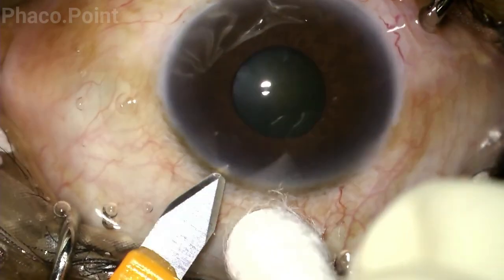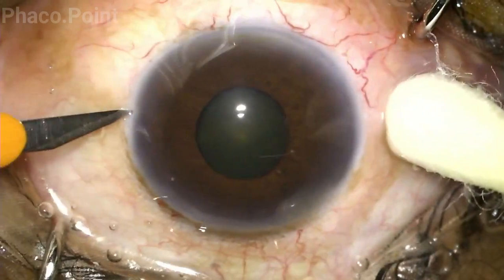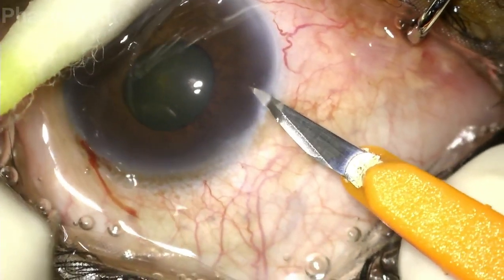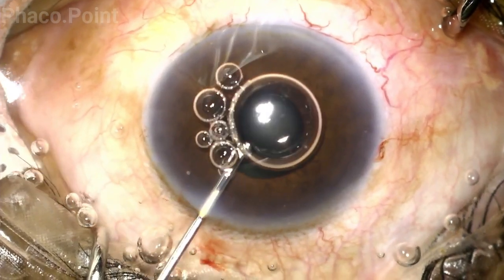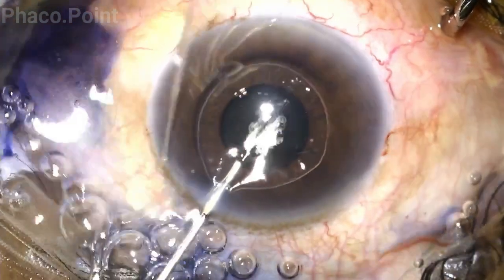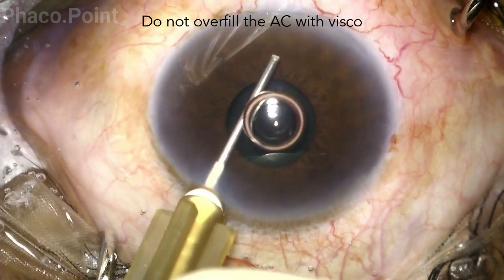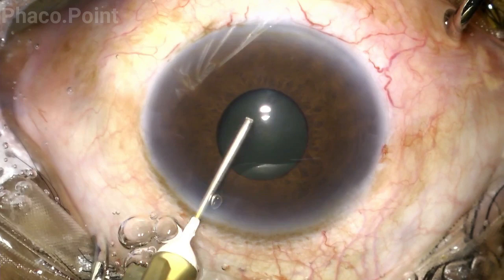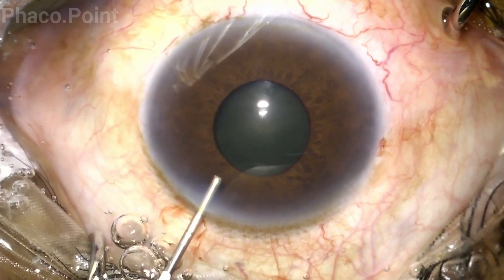One has to be meticulous and pay great attention to detail during the wound construction of both the main incision as well as the paracentesis incisions. The next steps in order of sequence are staining with blue dye, washing out of the dye, and then filling the anterior chamber with viscoelastic. Please ensure that you do not overfill the anterior chamber, which would result in the iris bowing backwards and can endanger the anterior capsule during the pupillary stretch.